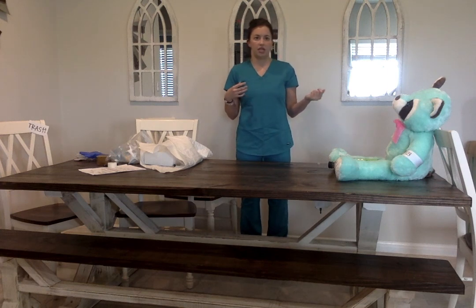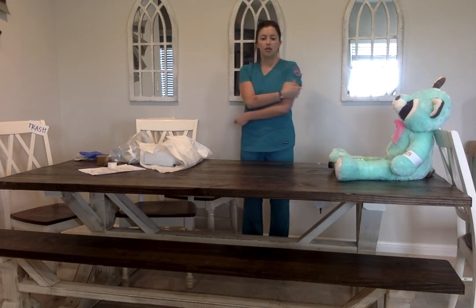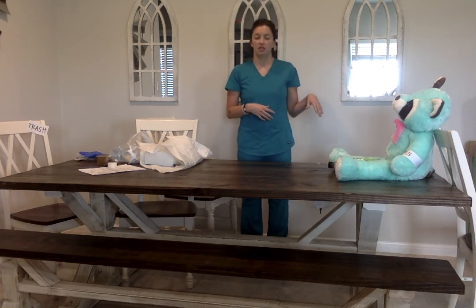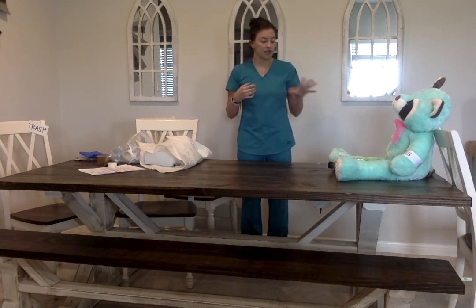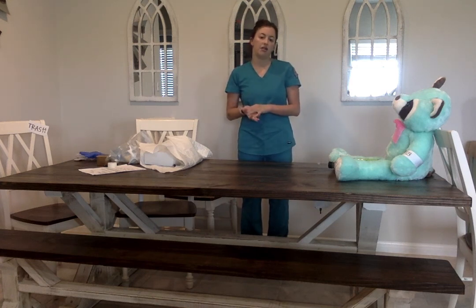I documented the location where I gave it to him and his response and everything, and he was fine. I documented the size of the catheter, his response, and color, clarity, and amount of urine.